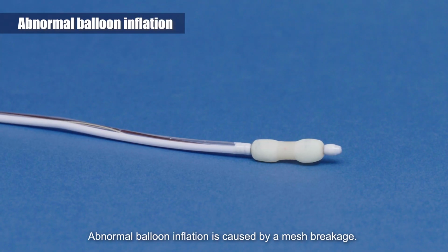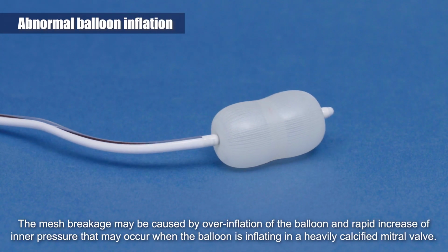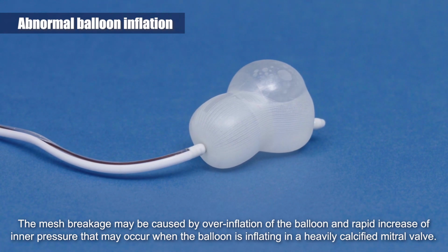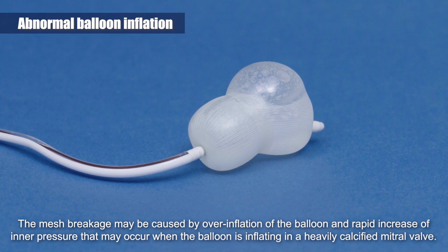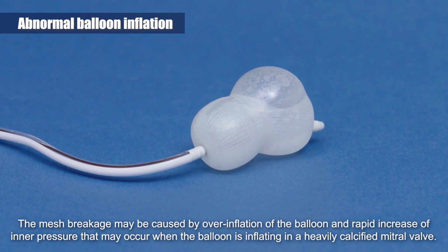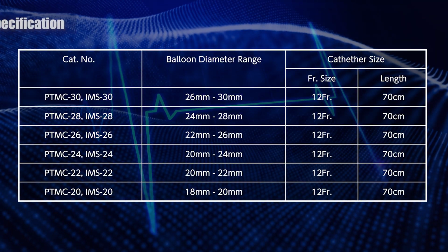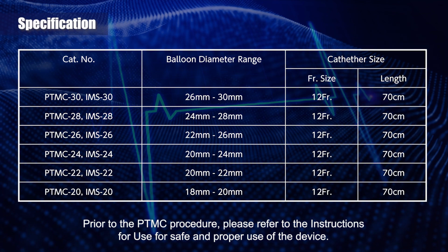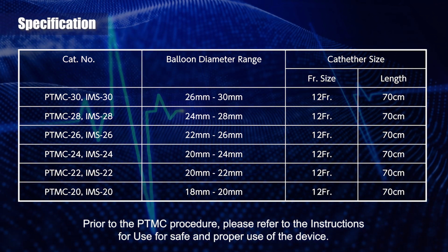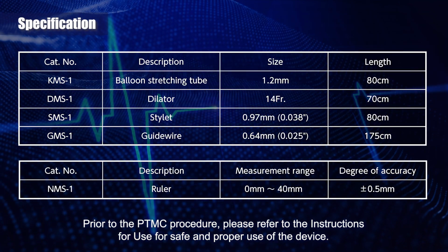Abnormal balloon inflation is caused by a mesh breakage. The mesh breakage may be caused by overinflation of the balloon and rapid increase of inner pressure that may occur when the balloon is inflating in a heavily calcified mitral valve. Prior to the PTMC procedure, please refer to the instructions for use for safe and proper use of the device.